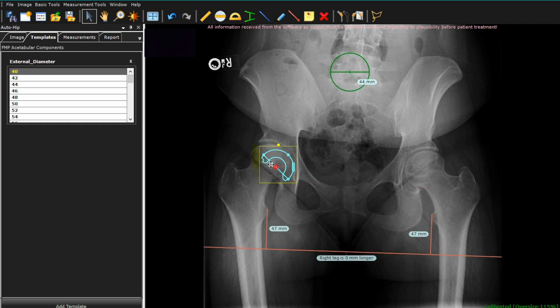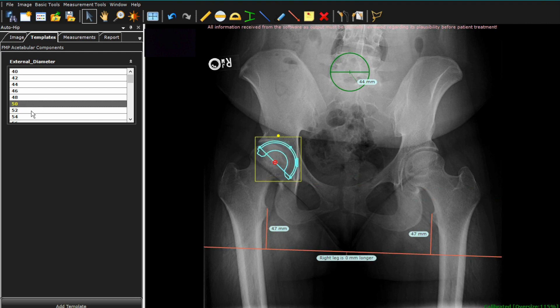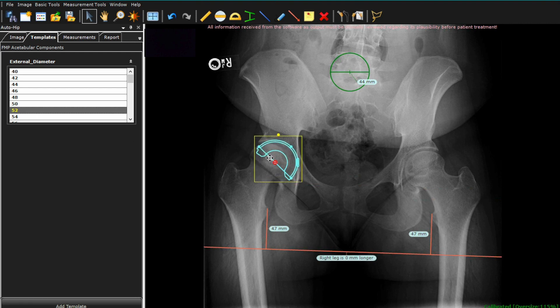I'll now drag that line out of the way, go back and select the cup, and now size the cup. This is a smaller patient with a 44mm femoral head, so we're going to start with the 50 or 52 cup. Typically in males the cup will usually be 4 to 6 millimeters larger than the femoral head, and in females 2 to 4. In this case a little bit large for a female, but this was the right fit.